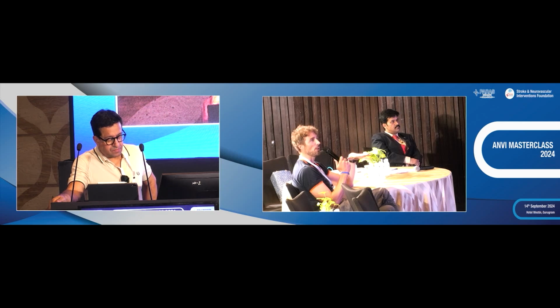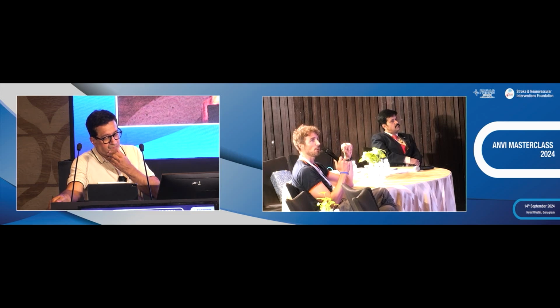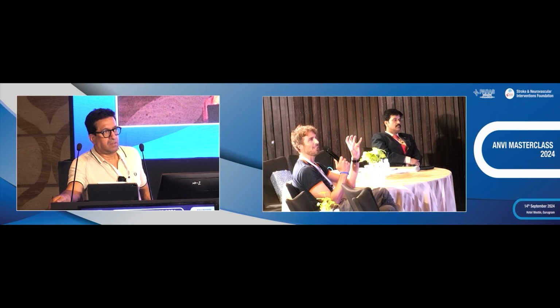So what we are doing is that we are sending the 3D anatomy into simulation software. I will illustrate in a few minutes a case, just an example of how we are doing it in a daily fashion in Montpellier and in other centers right now in the world. So we are putting the 3D into the machine, and we have the 3D representation of the sac. Then we are selecting the WEB according to parameters, the parent artery bulging, the apposition, but also now the compression, especially with the Artisse. Now we have the compression parameters, so we see how intense the force of apposition of the implant to the wall is.